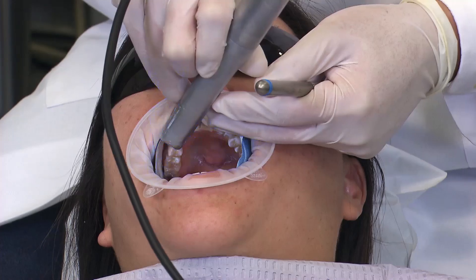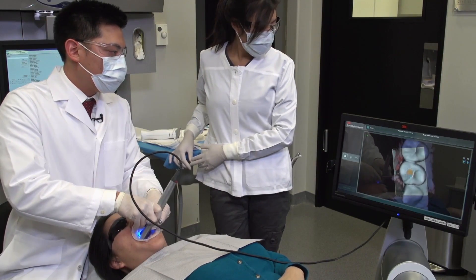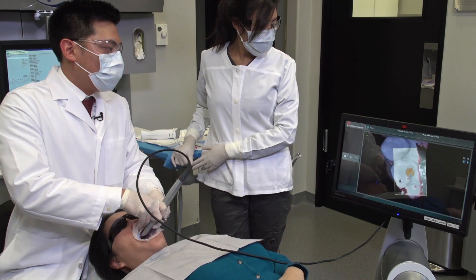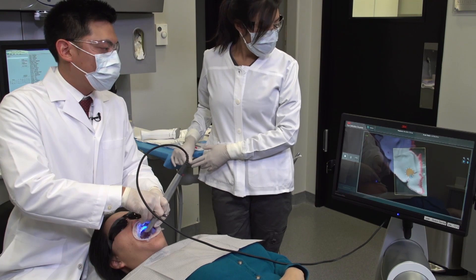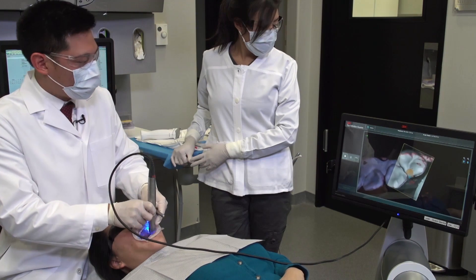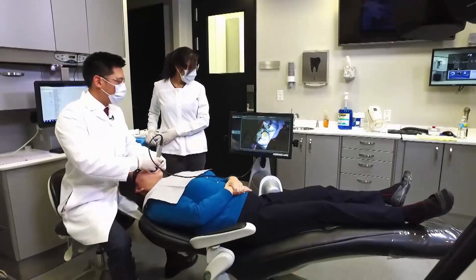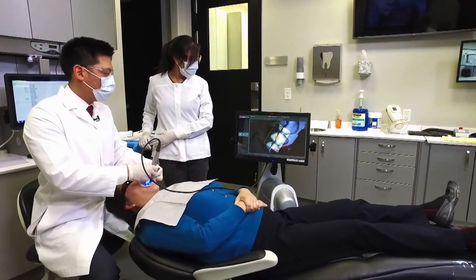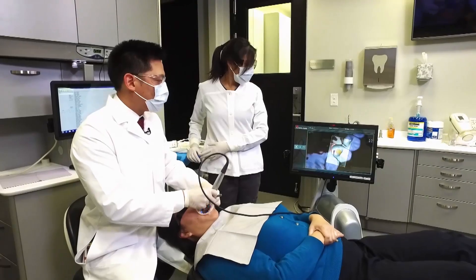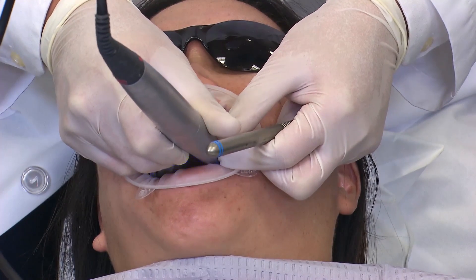Now I will transition on the anterior teeth to the upper left side. With the anteriors, it can be a little bit more tricky. If the system ever loses its place, you just return back to an area that it has already scanned — in that case, the upper right starting on number 5. Here I'm working on the linguals. With the anteriors, it can be a little more difficult because the incisal edges are pretty thin. Here it was able to transition well to the upper left quadrant, and I'll get all of the occlusal areas. Traditional impressions can be a source of increased anxiety and discomfort for patients, so digital impressions are a very nice application for patients who may have an increased gag reflex or have had bad experiences with traditional impressions before.